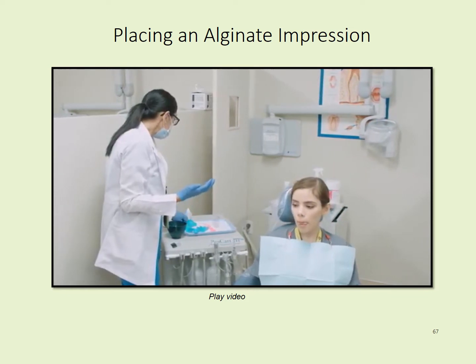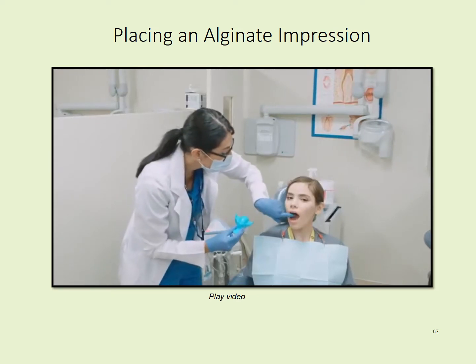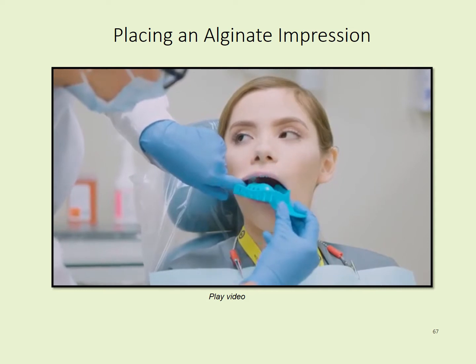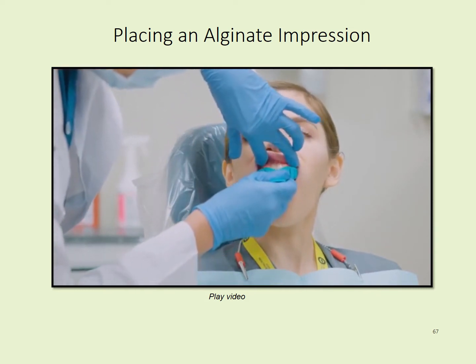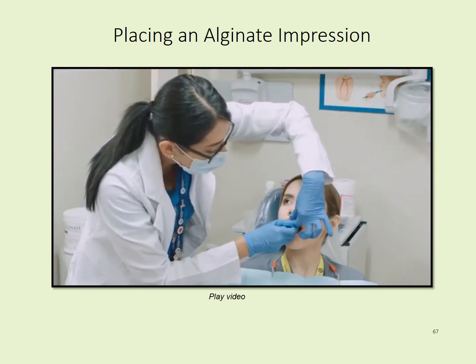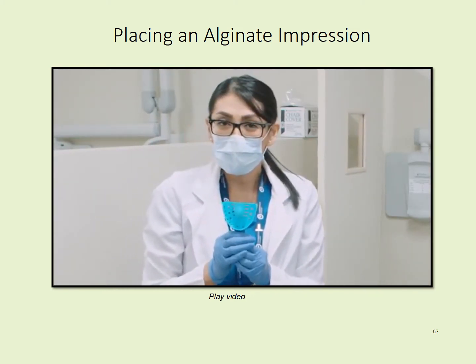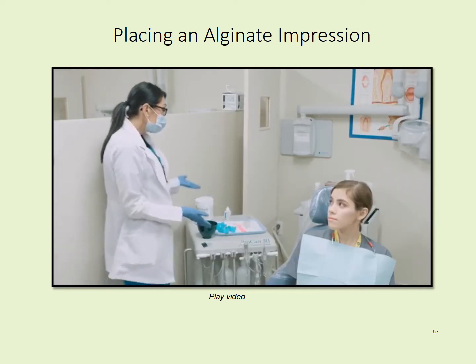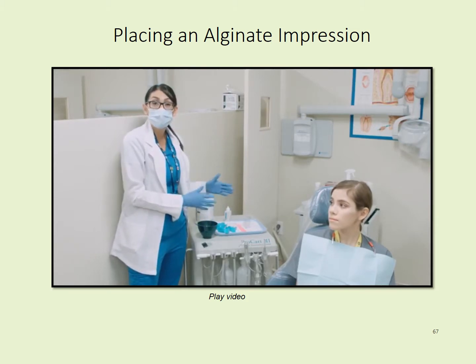So I'm going to go with my large. Again, we're going to do the same thing. Open big, retract the cheek with my finger, and swoop in the tray. Stay open for me, don't bite, and then I'm going to retract the lip and press the tray down. So now we have the impression tray ready for our patient. Now that we located the type of tray, we are going to start mixing and then place the tray. For demonstration purposes, we pulled the cart up closer to the patient so you guys will be able to see me mixing and going through the procedure.